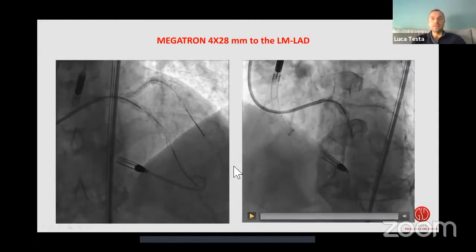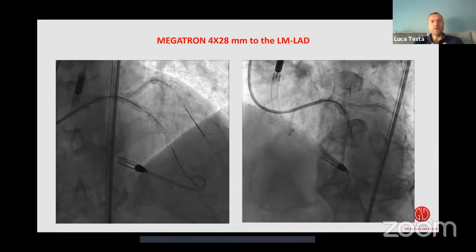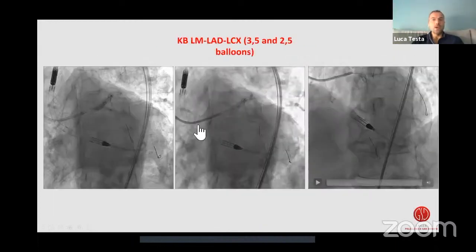Yeah, I have to say that usually I cover the ostial left main when the disease is diffuse, even when there is non-significant plaque. However, when I have space and the left main is really tapered, because the ostium is very large, I try to avoid this approach. Of course, I have no data to say that it was the right approach, but the initial result actually convinced me that it was not a good idea, and I'll show you in a second. So after stenting the left main LAD, I did a kissing balloon, as usual.